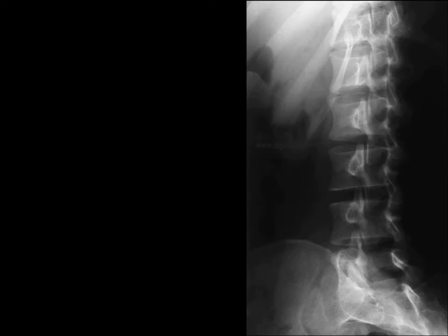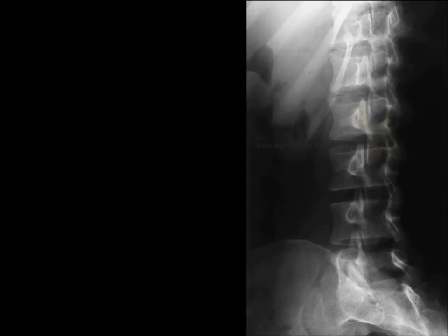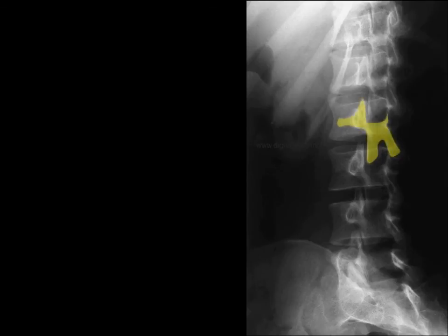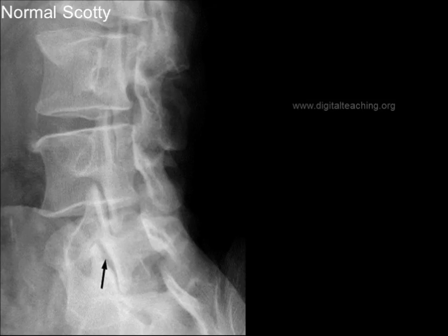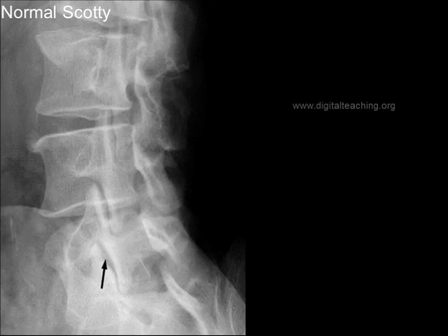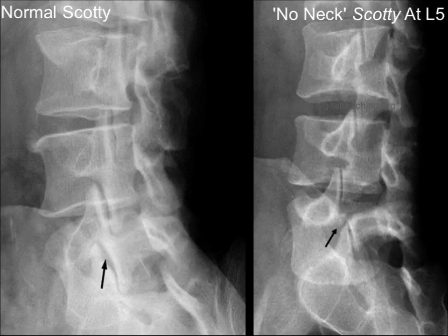Here is the normal Scotty. And here is the normal Scotty. And neck fractured Scotty dog.